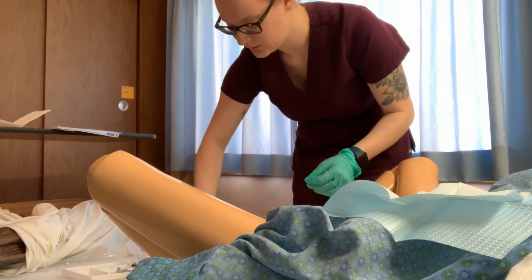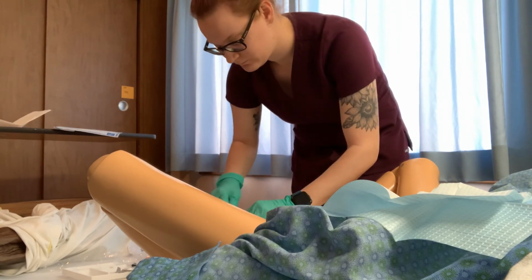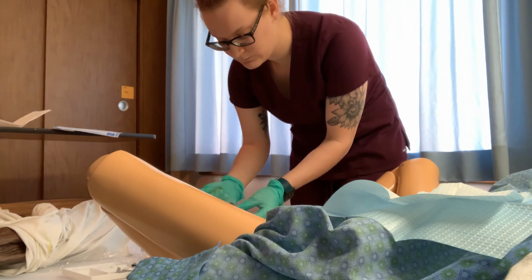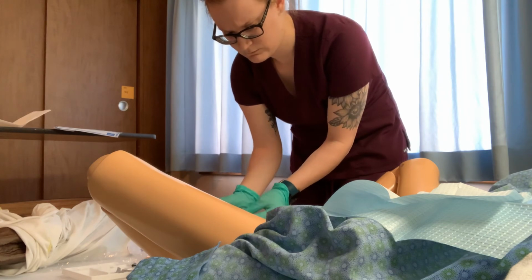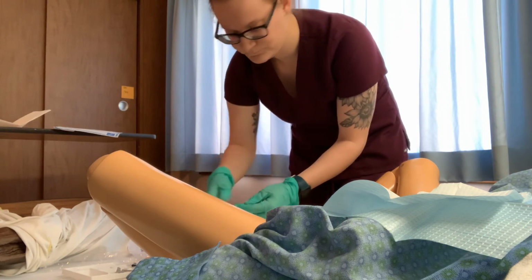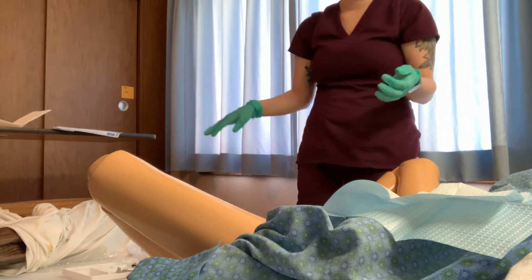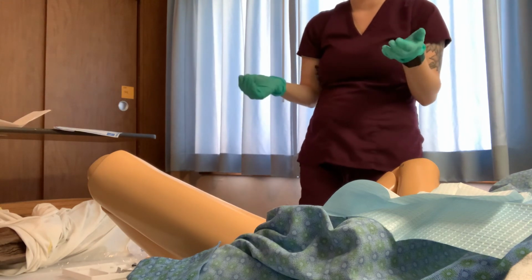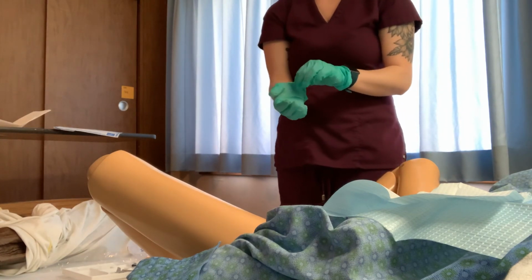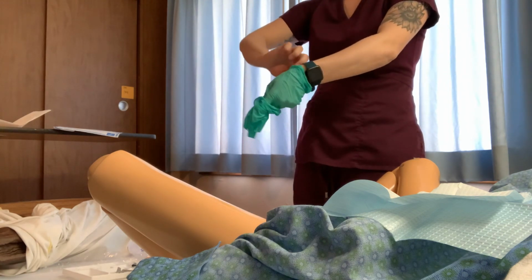To remove the catheter, you'll take a syringe and you'll apply it to the catheter. And you'll take out the liquid that's in the balloon and gently pull out the catheter. When you remove the catheter, you always want to empty the bag also and keep track of urine that is coming out. It is important to make sure that they're hydrated. And you'll clean up, don off the gloves, and wash your hands.